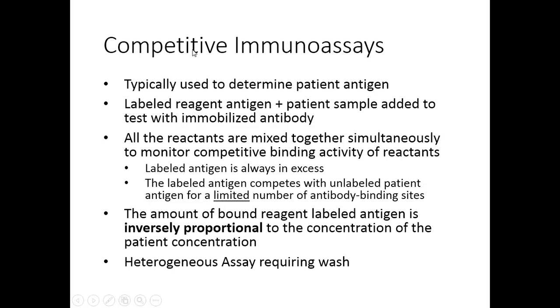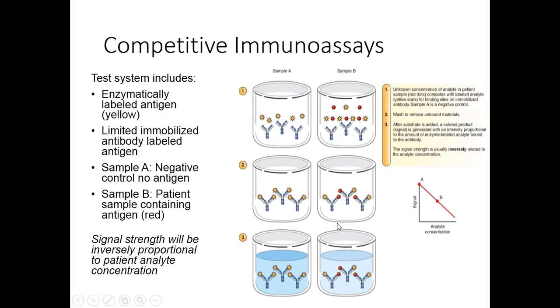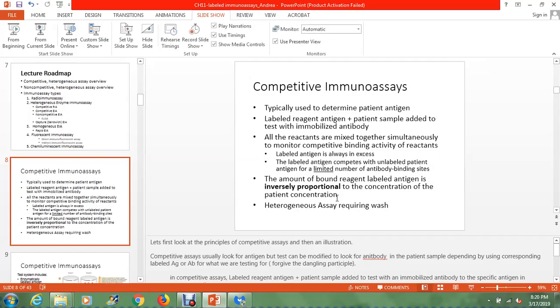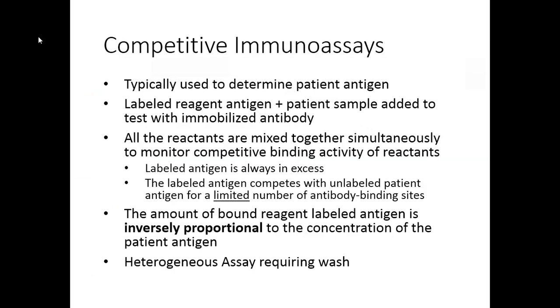It's really important. In competitive assays, always, the amount of bound reagent, labeled antigen that binds to the immobilized antibody, is inversely proportional to the concentration of the patient antigen. Sorry to be editing this at the same time, but I might as well get it right.